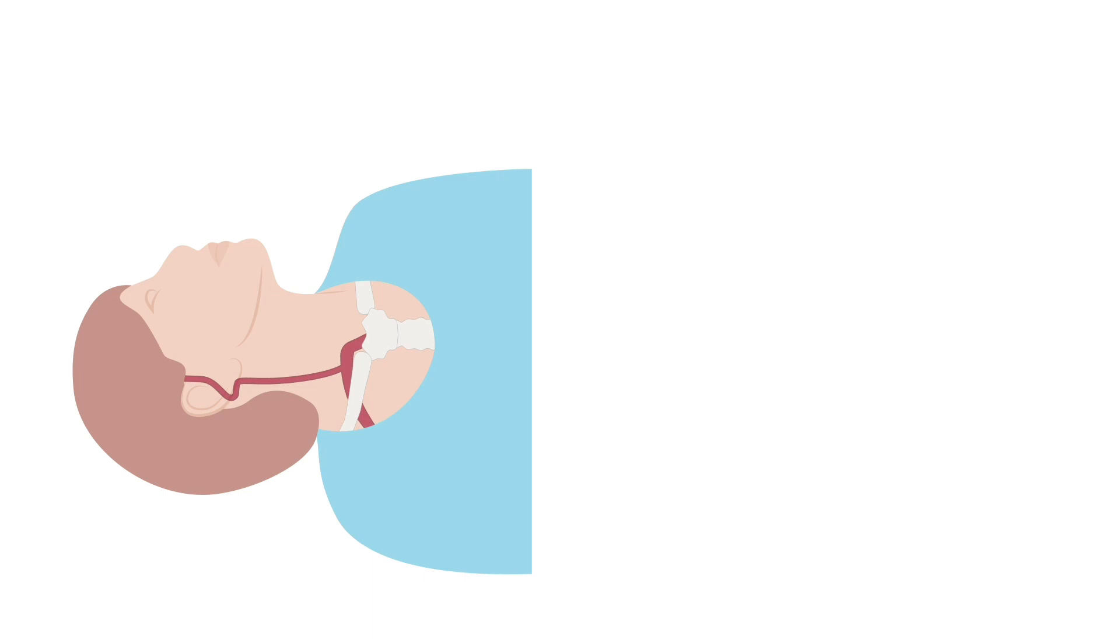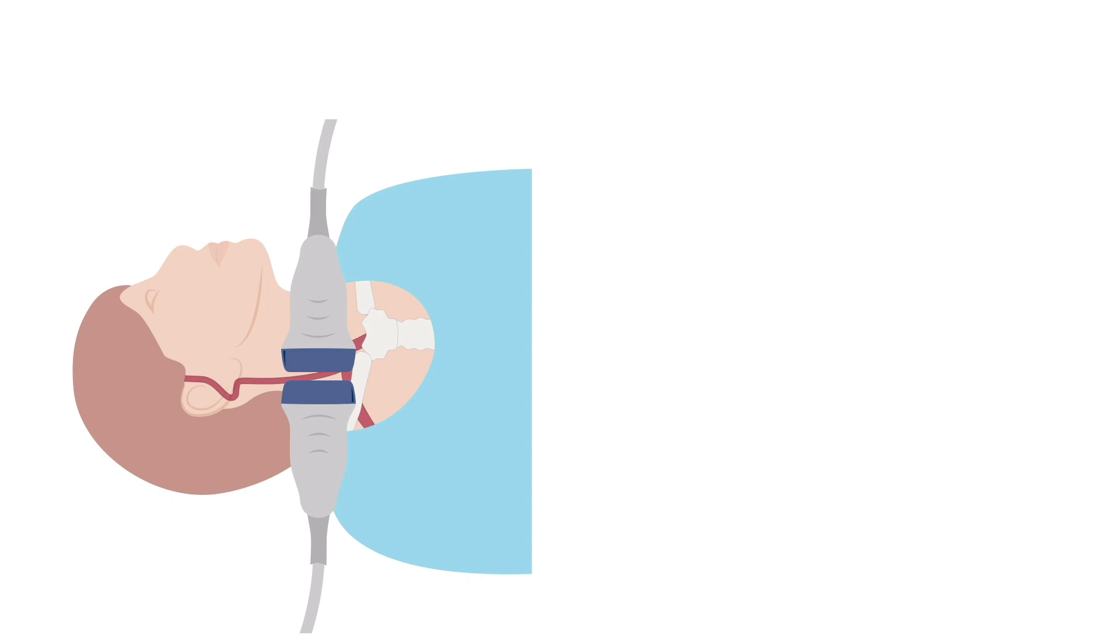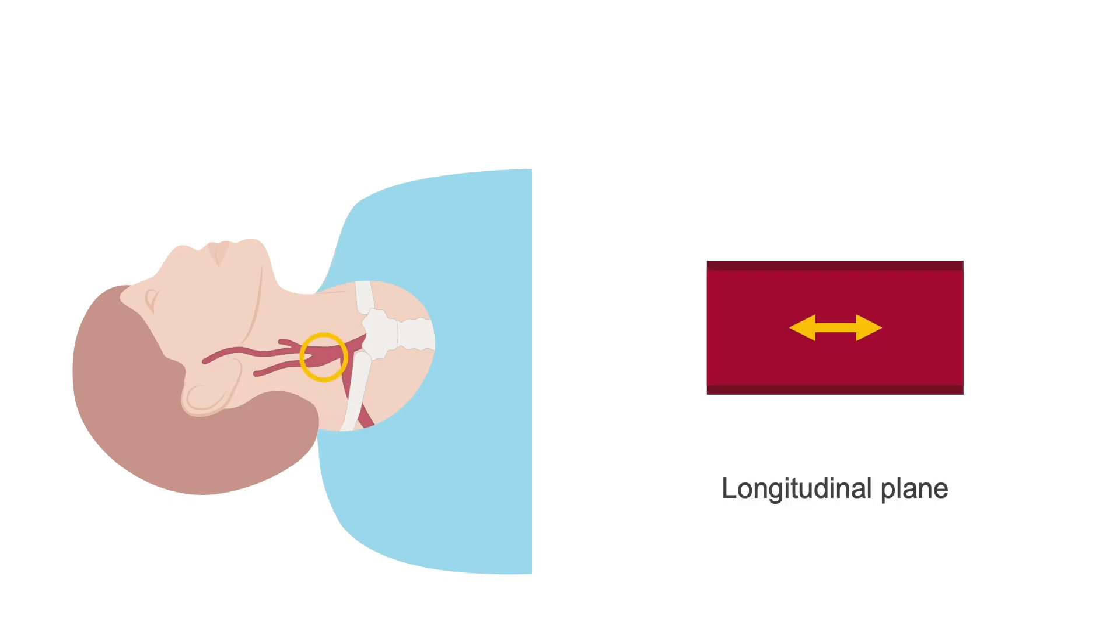To complete the investigation, the vertebral artery needs to be assessed. This is usually best scanned with the patient's head positioned straight and using an anterior or lateral approach. The vertebral artery can be located by first imaging the mid-CCA in the longitudinal plane.